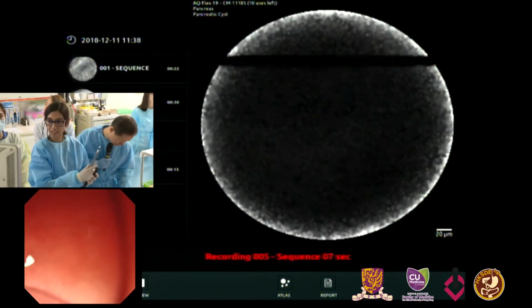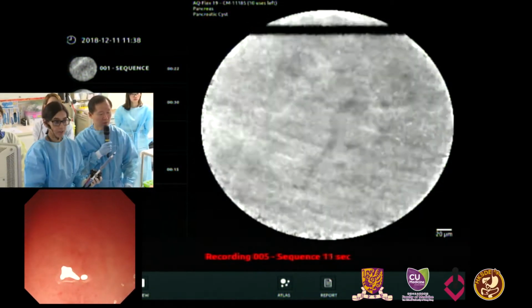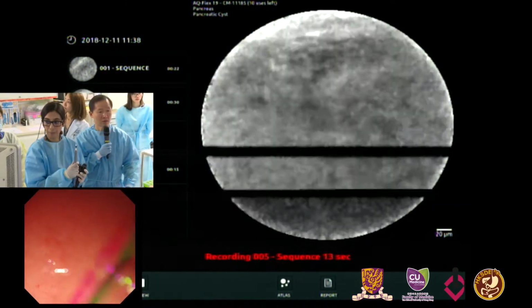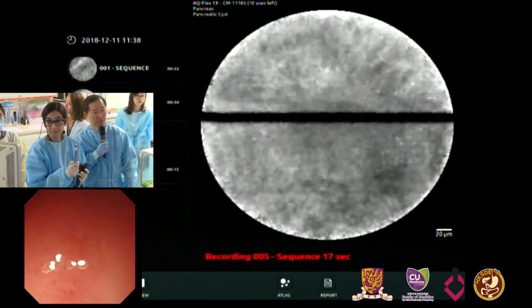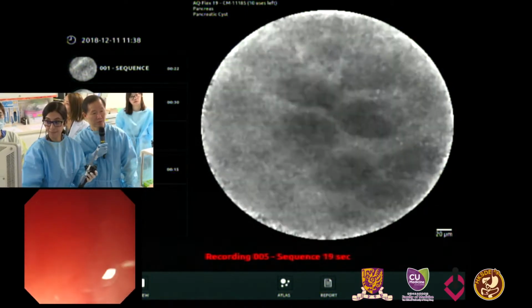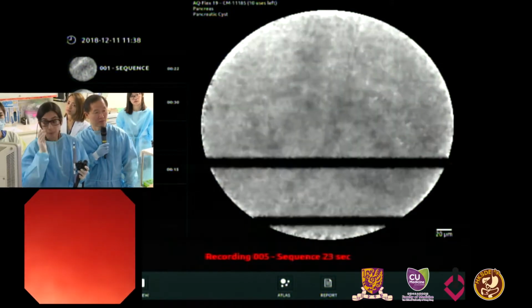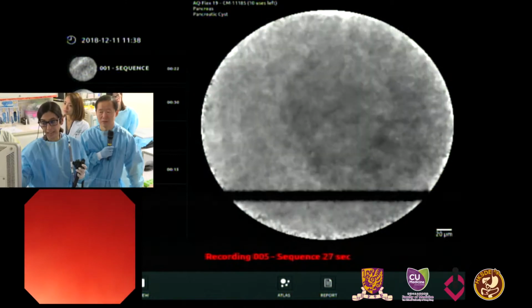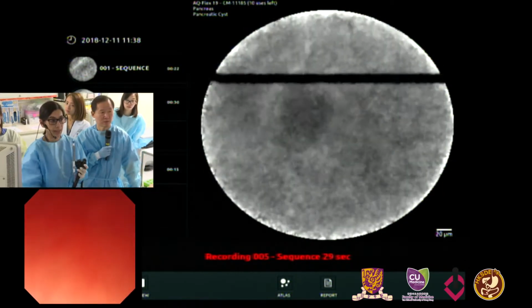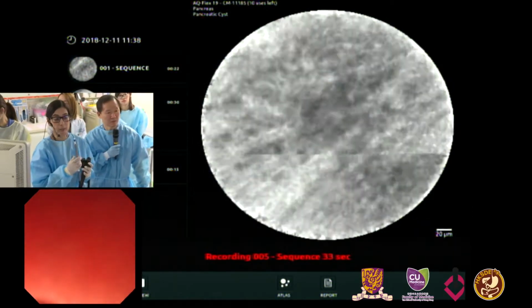Do you ever aspirate the cyst before you do endomicroscopy to be able to approach the wall better? If you have a very large cyst, do you aspirate some fluid? Yes, sometimes I do, to be able to approach the wall. But in this particular case, I was able to get to the very deep back wall, and now I just pulled back. So I didn't really have any trouble getting to the wall. But that is something that we do if it's larger.